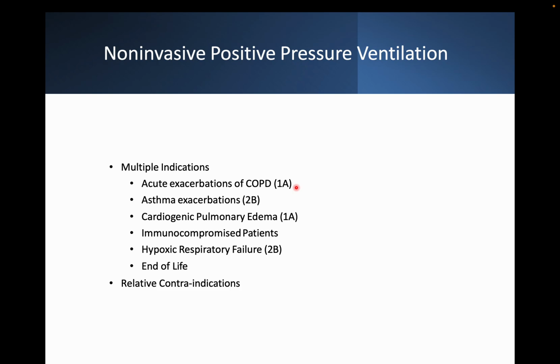Generally, non-invasive ventilation is the preferred ventilation, especially in the case of COPD patients, any asthma exacerbation, pulmonary edema, or initial stages of ARDS. In them, we have CPAP and BiPAP. So what is CPAP? CPAP is continuous positive airway pressure. It generally puts a continuous pressure.